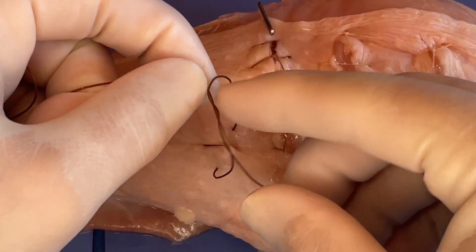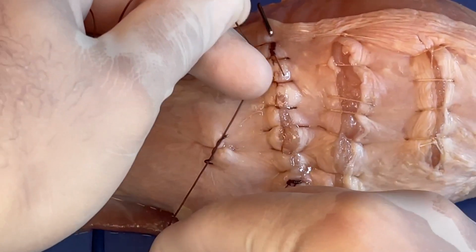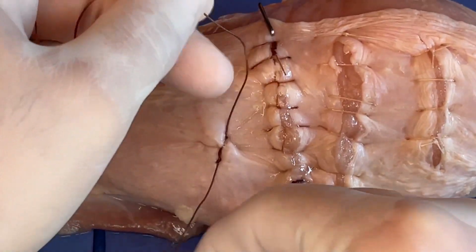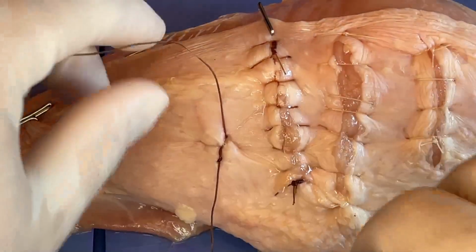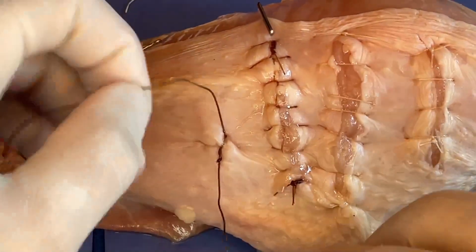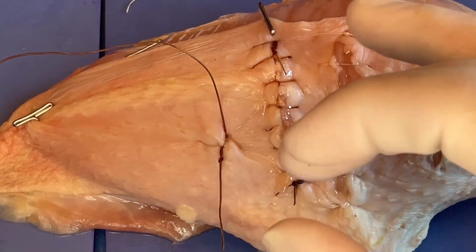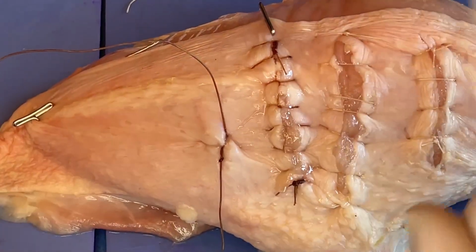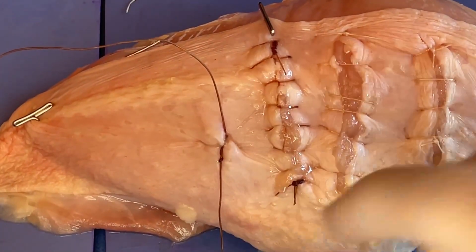So now we've got 2 wraps of the suture together. You can see it's a little bigger, a little bit harder to pull down, but as we pull that, it really compresses that, and now we can take tension off of it, and it stays quite tight. So that's the benefit of the surgeon's knot, is that when you cinch it down just with a single throw, so to speak, although we have 2 wraps, it keeps it nice and tight.